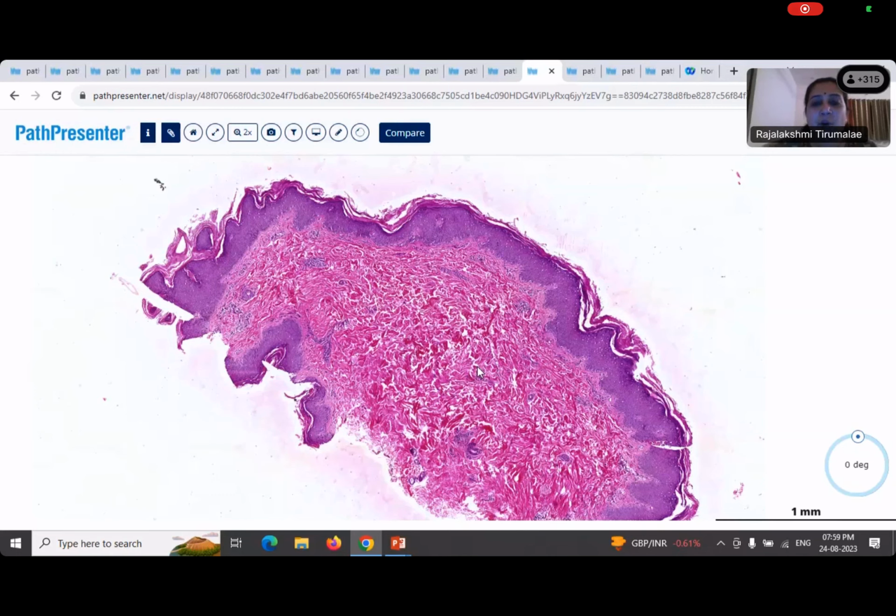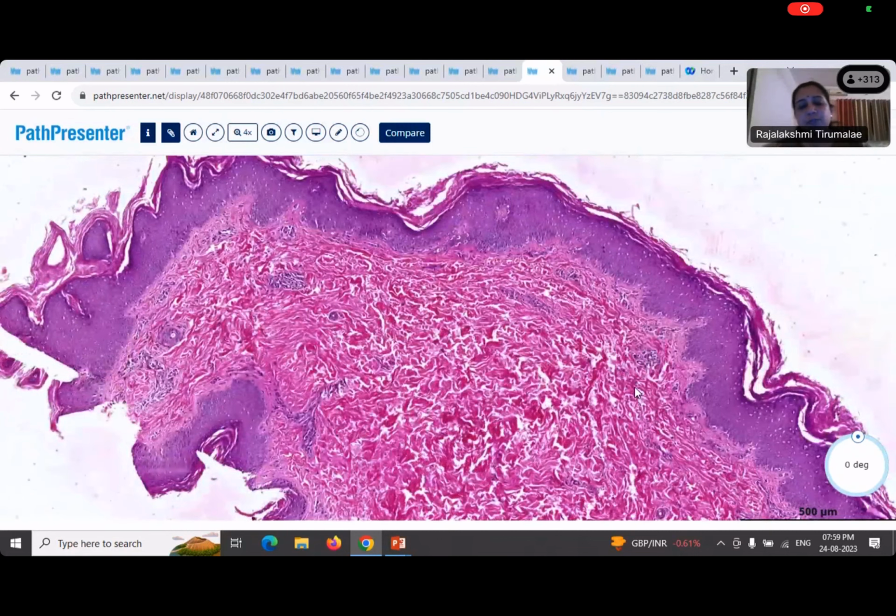The reason for my giving you this biopsy is that sometimes even in what we think is suboptimal, there is something. So we have to be careful. Do you see any infiltrate in the dermis? You've seen so many cases with dermal infiltrates till now. Yes, ma'am, but not that obvious. Not that obvious. So I think you've picked up the findings very correctly.